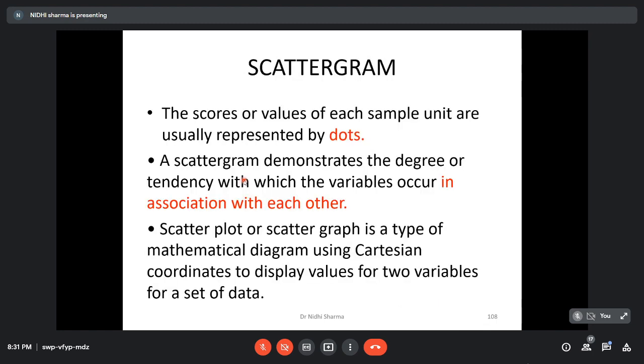And as I said, in WBCs we are more comfortable looking at the scattergram, because we are talking about different kinds of leukocytes in association with each other, the relationship of their counts, and whether we are getting any merging data. Therefore, I will discuss the scattergrams in much more detail for WBCs rather than the histograms.